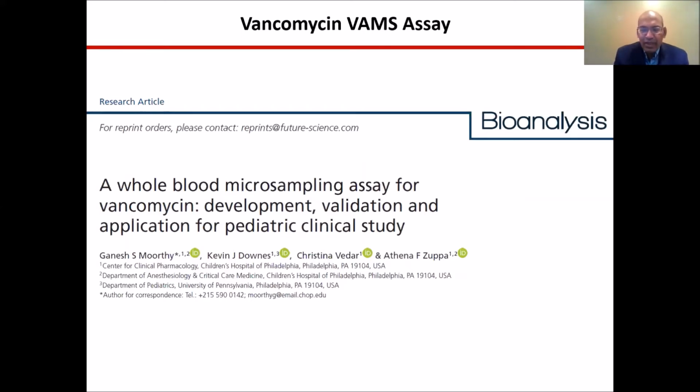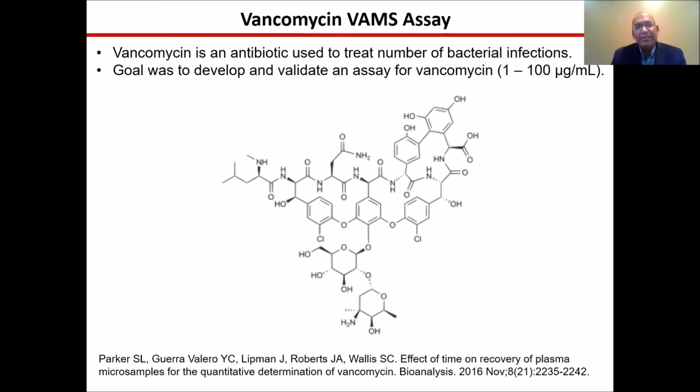In terms of vancomycin, as the audience knows, it's a chemically very interesting compound, which brings some analytical challenges early on, especially when working with small volumes. However, since the compound was quite sensitive in our instrument, we were able to develop a robust assay within the acceptable range for the purpose of the clinical study.